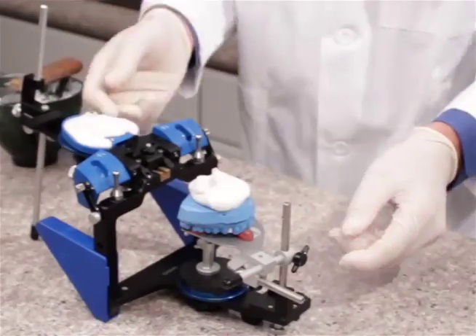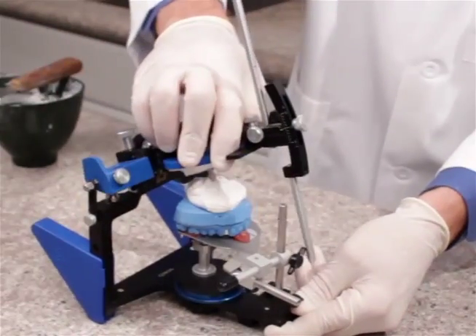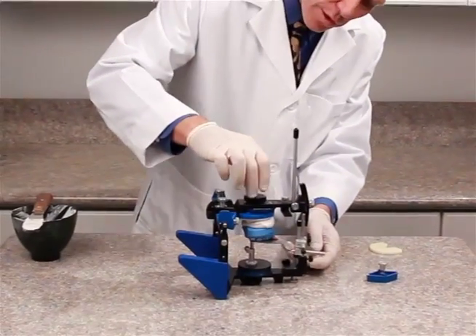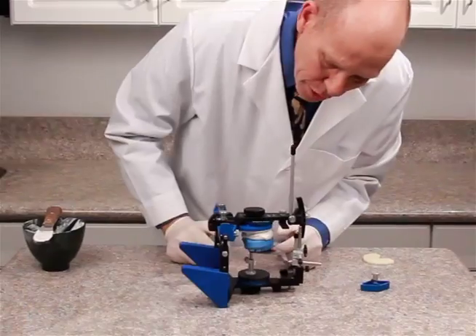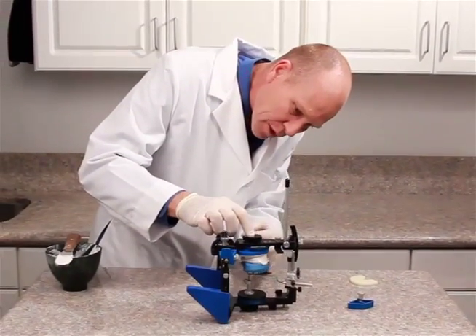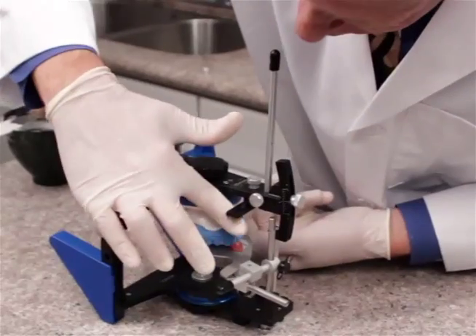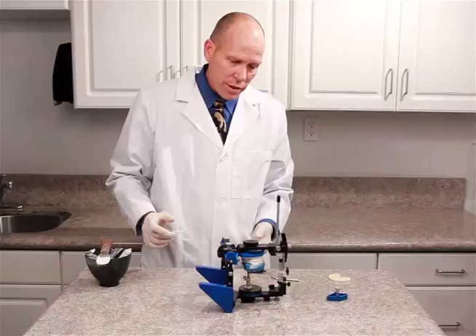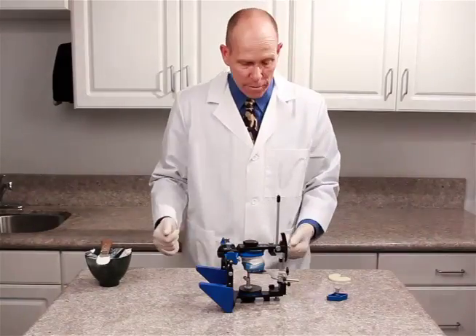Now we can swing this around until the incisal pin touches the mounting fixture, making a connection of the cast to the mounting plate. If there's any plaster that's extended beyond the realm of the mounting plate, we can go ahead and wipe some of that away. That'll give us room to add plaster later to beef this up and make it look clean. We'll go ahead and let this set.